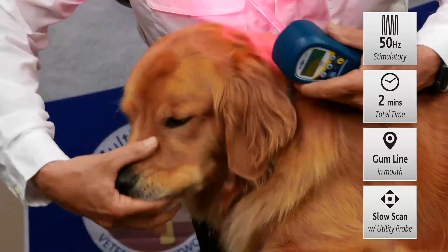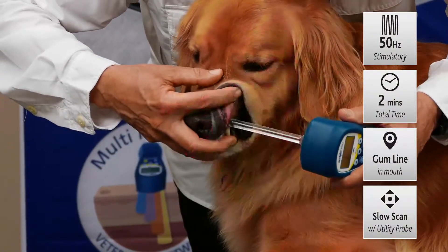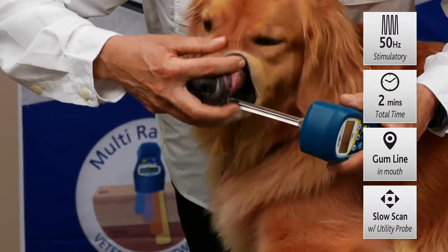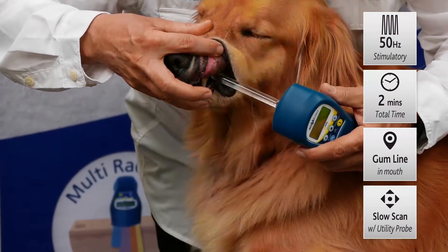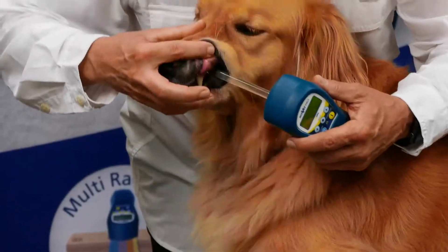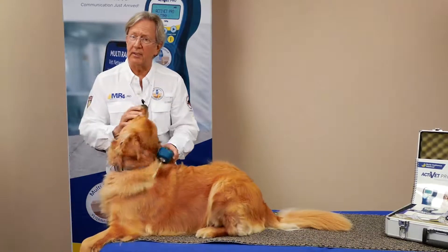Now we can just come in, reach in gently, and put the probe right along the gum line where you're having the issue, and just slowly move at a centimeter per second right along that gum line. Good girl, Tango — thank you. It's just that easy: gently back and forth at about a centimeter per second right in that area, and you'll see a lot of benefits from using laser therapy.